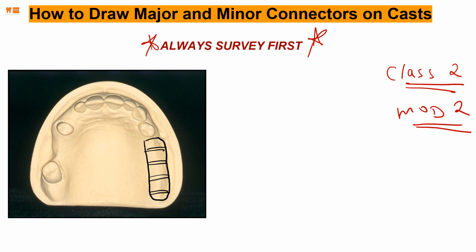And then of course the denture base comes out just like this, 45 degrees. And same thing on the other side, mesh work, denture base, 45 degrees, 45 degrees.